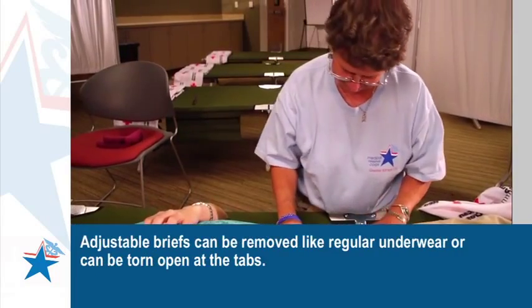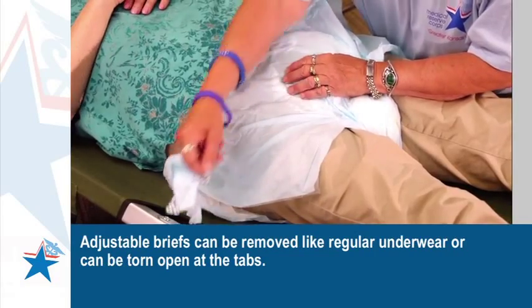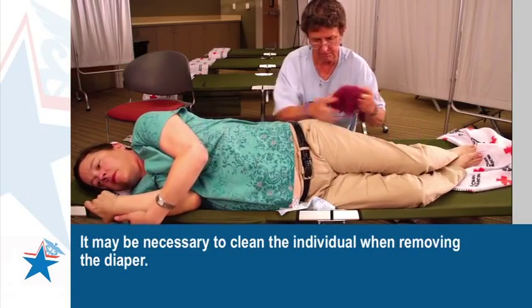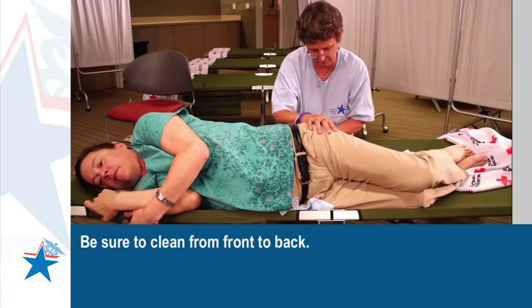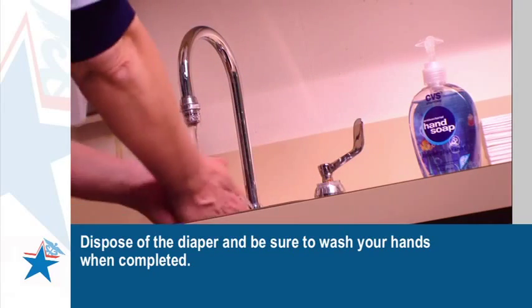Adjustable briefs can be removed like regular underwear or can be torn open at the tabs. It may be necessary to clean the individual when removing the diaper. Be sure to clean from front to back. Dispose of the diaper and be sure to wash your hands when completed.